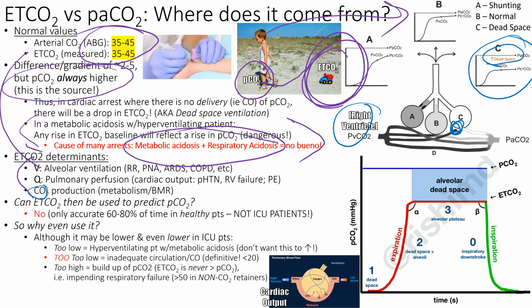And then, of course, the ventilation portion. So I have a really bad, right here, it looks like an emphysema patient. They have a collapse of the distal airways right there, right? So they're unable to get air in effectively and also unable to get air out effectively. So they have a shunt problem happening here, VQ-wise, but they're also not going to be able to get the CO2 out as effectively. The CO2 starts building up, building up, building up. You're going to see a rise in your end-tidal CO2.